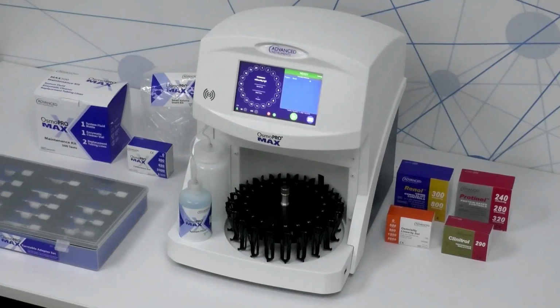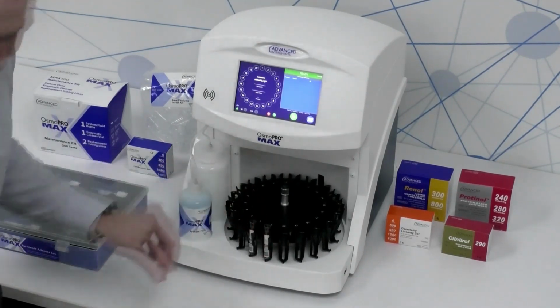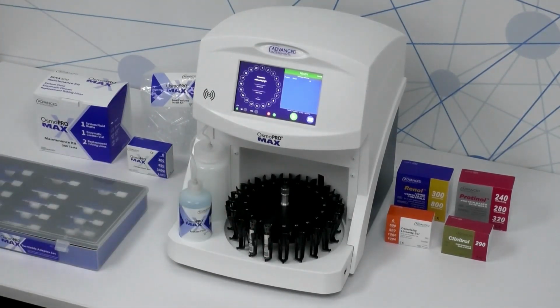So now that we've reviewed the user interface, I'll show you how to run samples on the OsmoPRO MAX. Primary sample tubes can simply be placed on any open position on the turntable. The turntable accommodates a wide range of tube sizes, ranging from 11 to 17 millimeters in diameter and up to 100 millimeters in height. As far as the minimum sample volumes, approximately 450 microliters is required when testing directly from a primary sample tube. This will vary slightly depending on the tube dimensions.